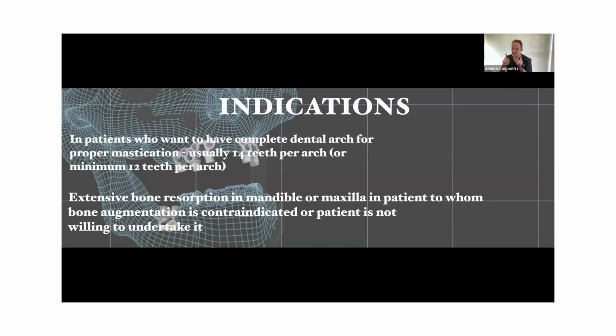This is the important thing. This is not only the surgical procedure, because as you know, if you have some surgical skills, also with the zygomatic implant, you can do it. But the problem is if you have some problems, some issue. If we have some issue, be careful, because with the zygomatic implants, we can have a huge complication, and also it's not easy to remove.